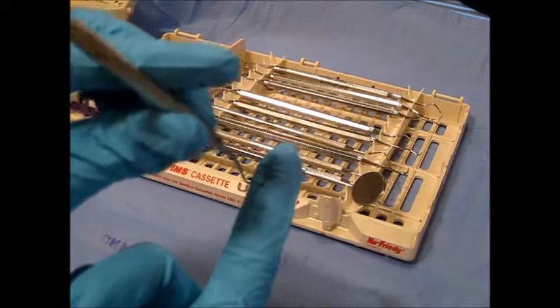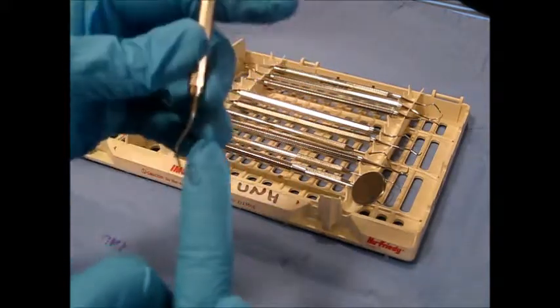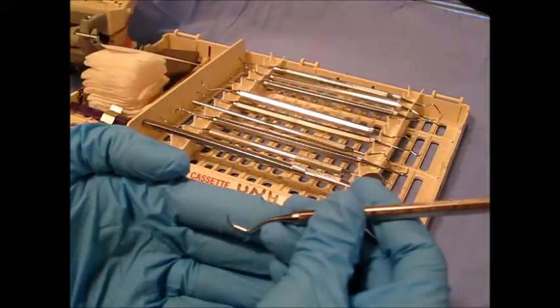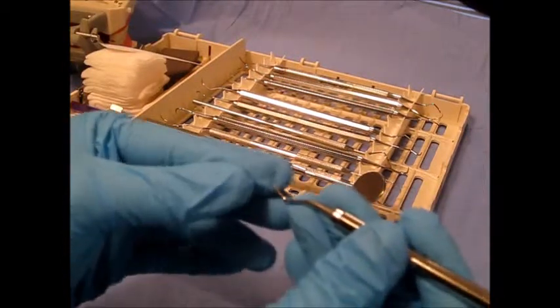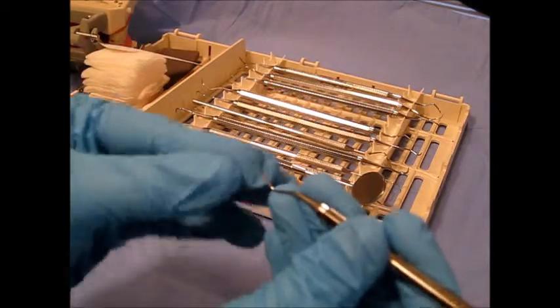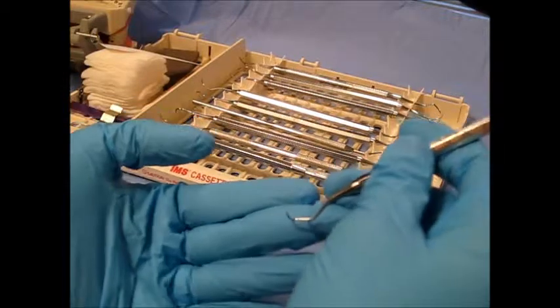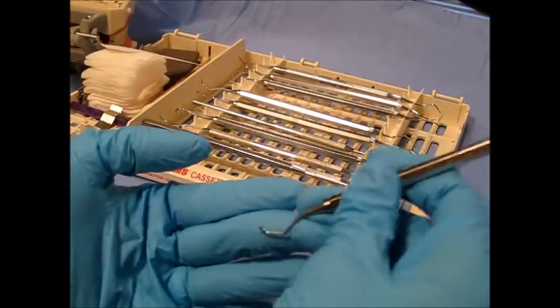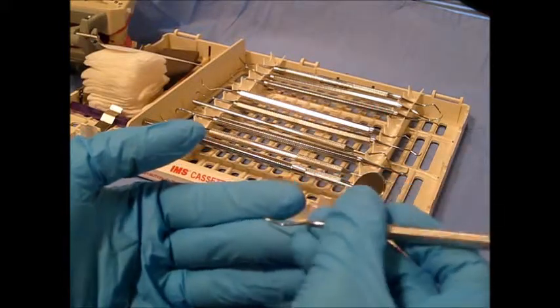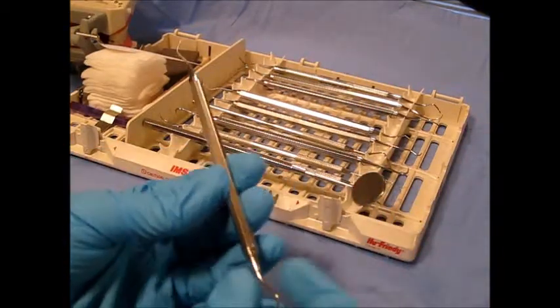This instrument is utilized subgingivally and supragingivally. The reason why this instrument can go subgingivally is because of its rounded semicircular cross-section. When we put this instrument subgingivally, it won't cause trauma or harm to the patient if we use it correctly, unlike an instrument with a triangular cross-section.